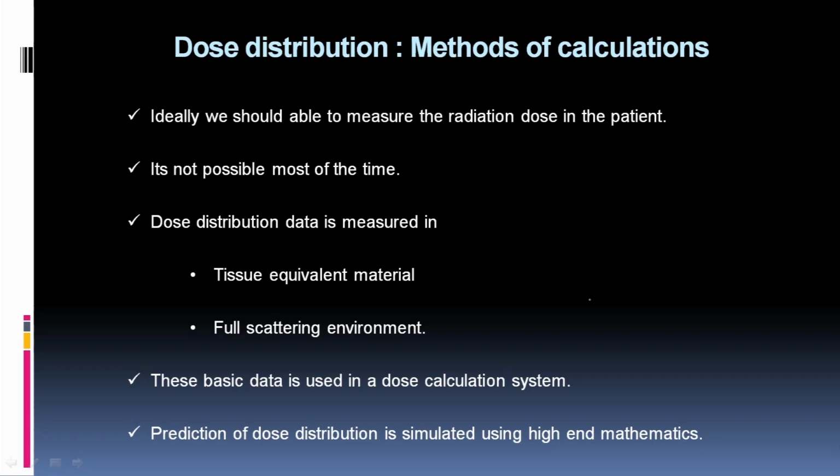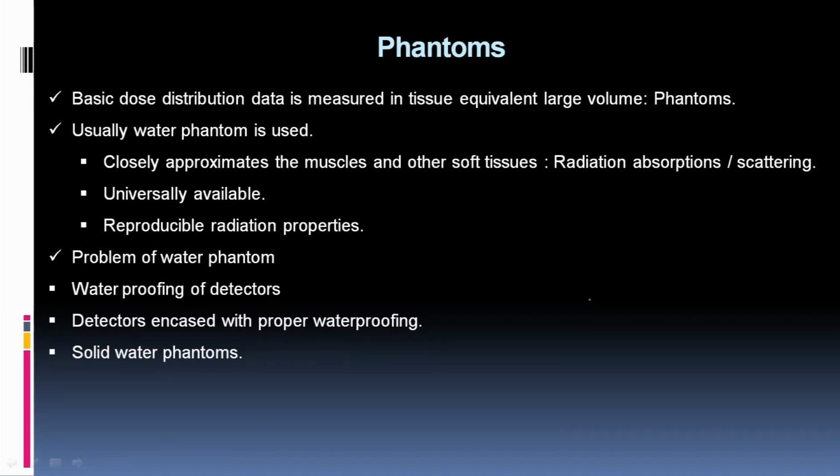These data are used to simulate or predict the dose distribution in the treatment of cancer patients. This is something we regularly use in radiation oncology.